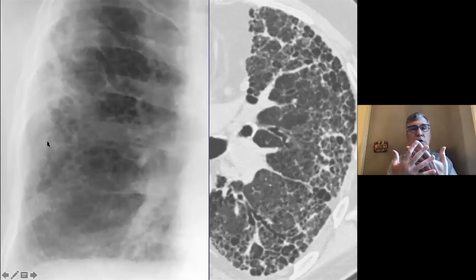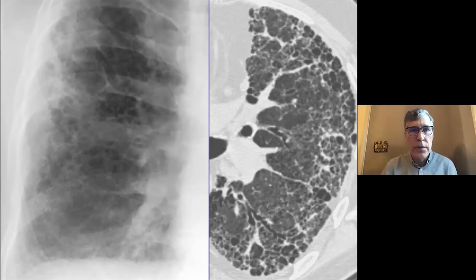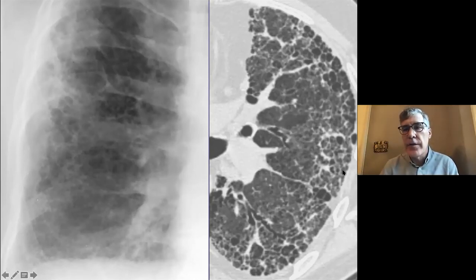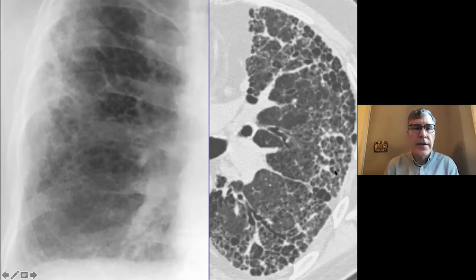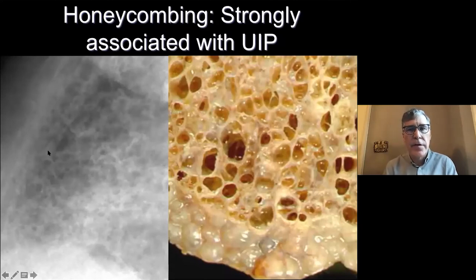What does fibrosis look like on the plain film? Reticulation and honeycombing looks like little crisscrossing webs of lines forming tiny ant-sized holes. That's what you see here — honeycombing: cysts forming these reticulations right up against the pleura peripherally. That's honeycombing, that's UIP. And once you say it, people are going to assume it's UIP.